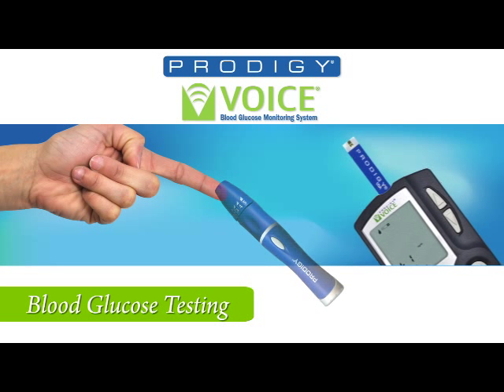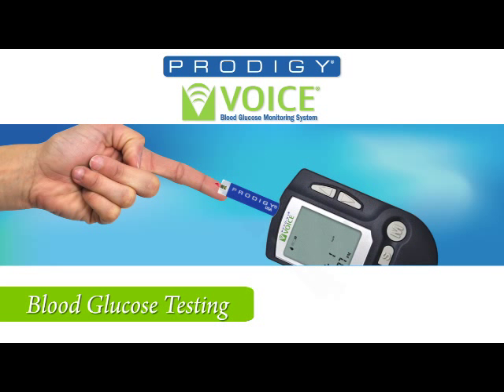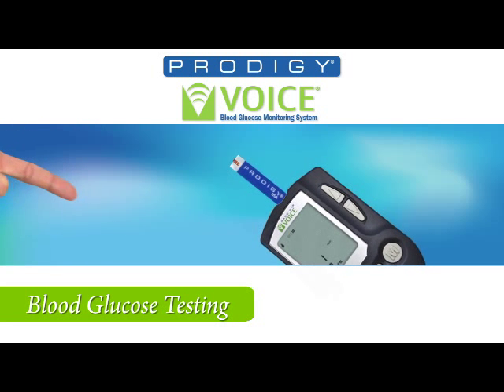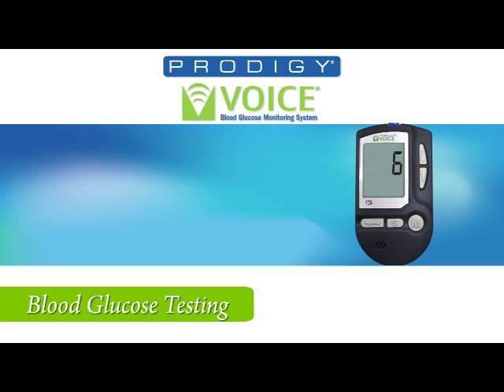Puncture your finger with the lancing device. Wipe off the first drop and apply the second drop to the test strip. When the absorbent opening is full, the meter will beep and you will hear 'Now testing.' Your meter will now count down from 6 to 1, show the results, and tell you the number: 'Your blood glucose, 105 milligrams per deciliter.'